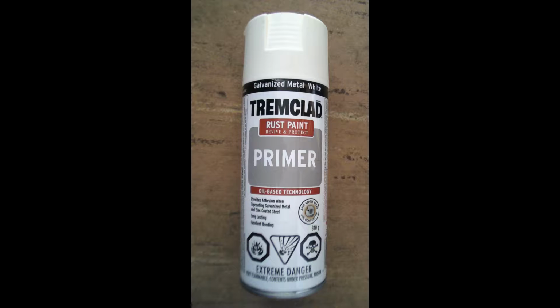Spray painting primer was straightforward. This was going onto bare metal. I had to choose the correct primer for the type of metal my wheelchair hubcap is made out of. Specifically, there is galvanized primer and non-galvanized metal primer. I've skipped using primer in the past. I did this to save money. It came back to haunt me because the paint job didn't last.